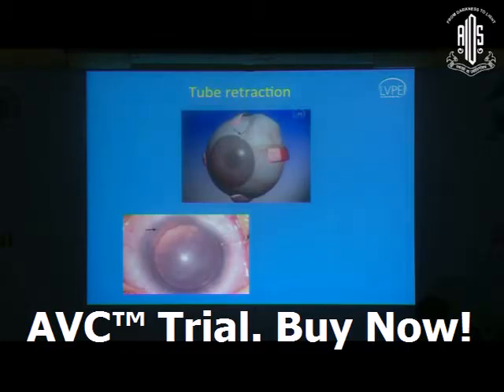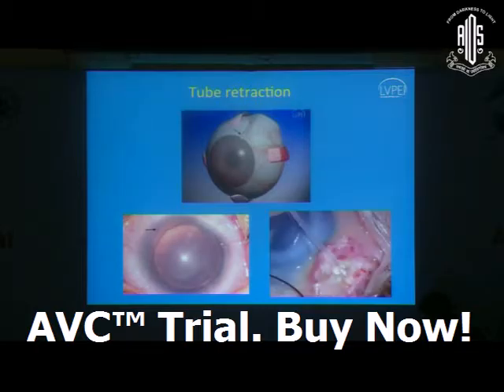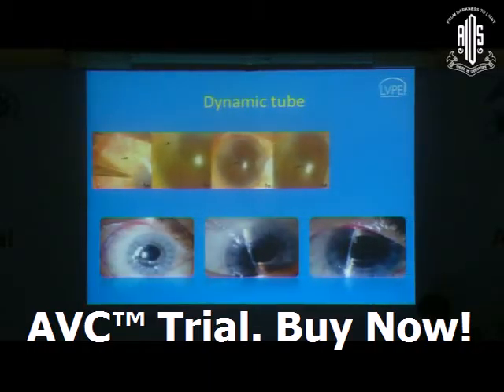Nowadays, if I had to do this patient, I would use a completely different technique, where we leave a long tube parallel to the limbus on the zonule so that it doesn't even reach anywhere close to the lens. This child had a tube retraction, and in a couple of other children, especially with aniridia, you can use a tube extender. It's not that you have lost the implant. If the implant is functioning well, you can use a tube extender to save the implant.